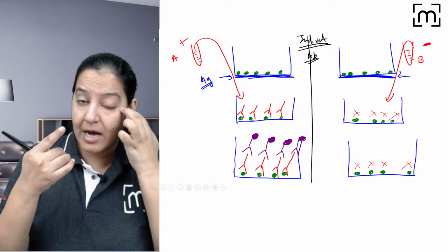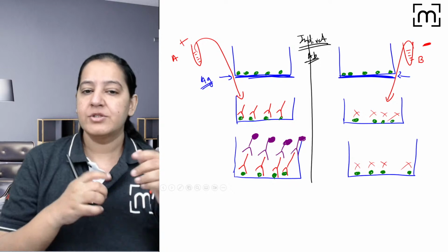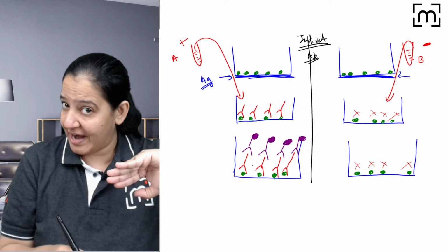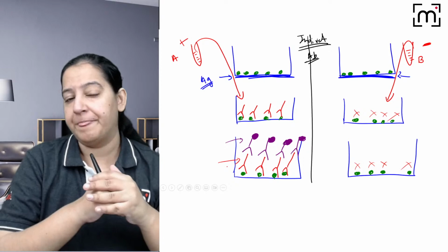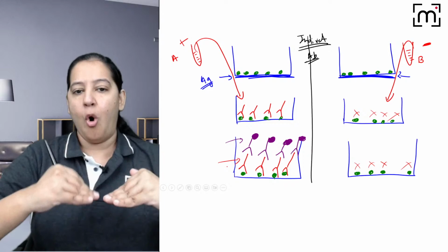Antibody against antibody, right? So can you see, here the bond will take place because the previous antibody is present, the red one, which is in the patient sample. So this purple antibody is external, right? But the red one is from the patient sample, right? Because the patient sample is positive, the red antibody is present. That's why purple will remain there. It will not go in washing. So all will form bonds above each other, right?